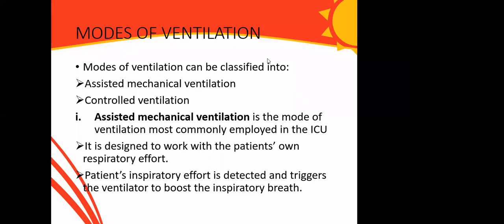Please help us. Modes of ventilation: there are basically two major broad modes of ventilation. We have assisted mechanical ventilation or controlled mechanical ventilation. Suffice to say here that we're looking more into mechanical ventilation in the ICU setting, and the commonest mode used in the ICU is assisted mechanical ventilation.